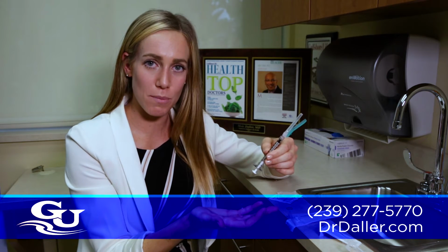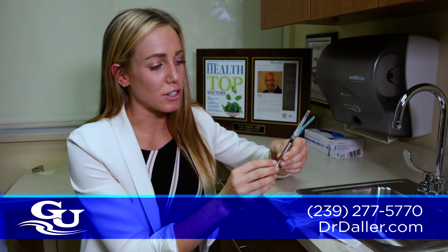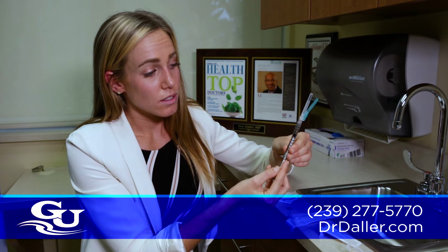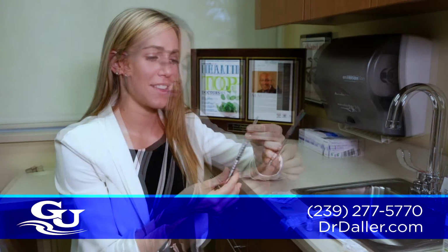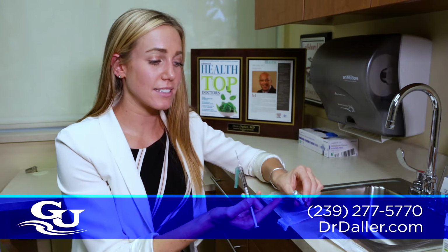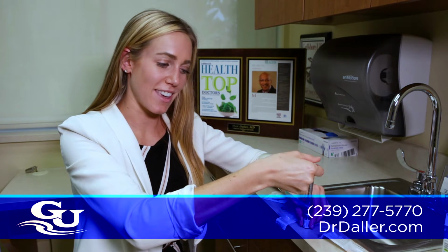To avoid a negative vacuum effect, you want to fill your syringe with the amount of air that you would want fluid coming from your vial. So for this demonstration, we're going to use a ½ cc, which is equivalent to ½ of a milliliter. So we draw up like this, and you want to measure to the top of this black plunger. Remove the cap from your needle, and you want to inject the air into the vial. So find the center of this gray circle right here. Stick your needle in and inject the air.